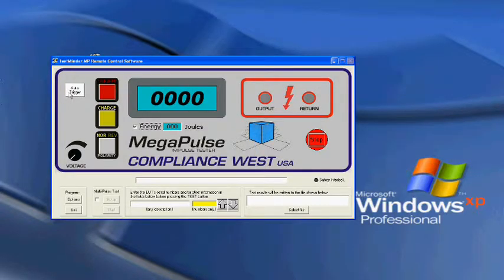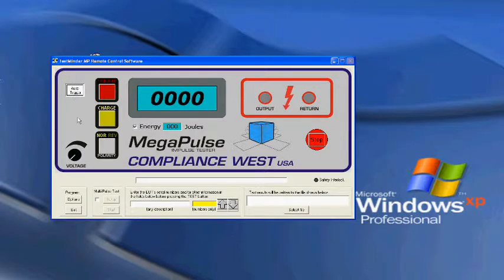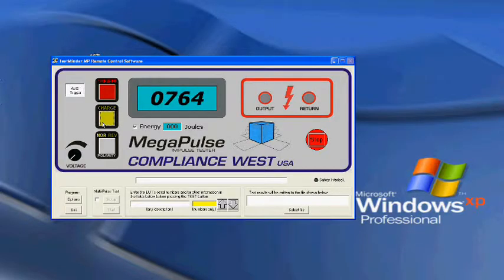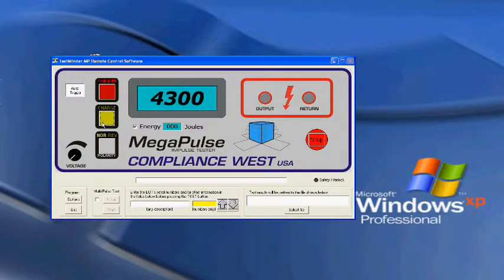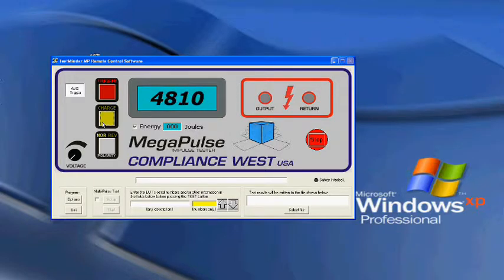Then click on the Auto Trigger button and press the yellow Charge button. After the voltage reads 5,000 volts, the pulse will be delivered and the energy is displayed.